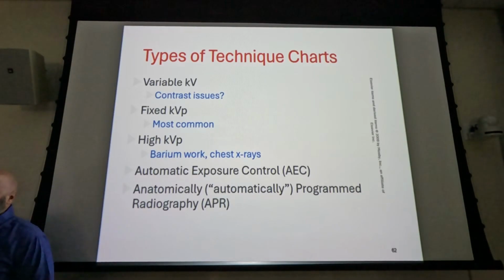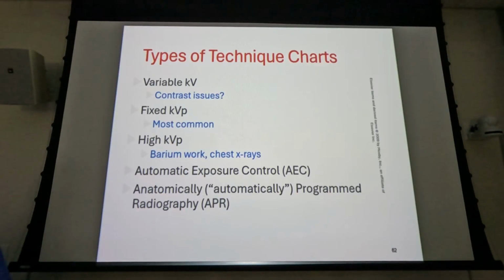Okay, so you teach something a certain way for a long, long time, and a whole lot of people hear something for a long, long time, and they have a hard time getting away from it, right? So kVp controls contrast? No. No, but you might hear it from somebody.